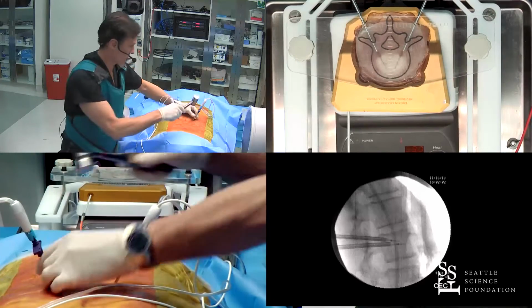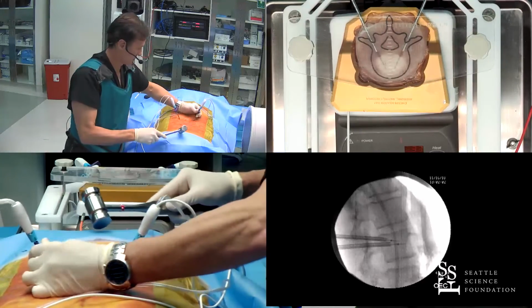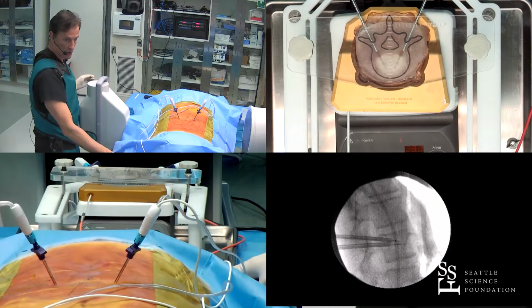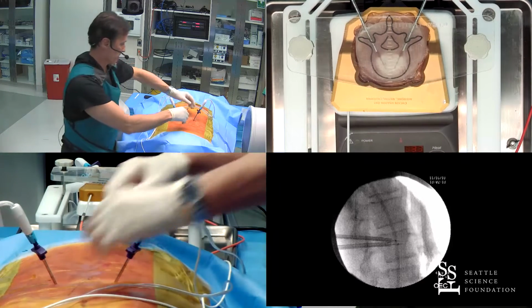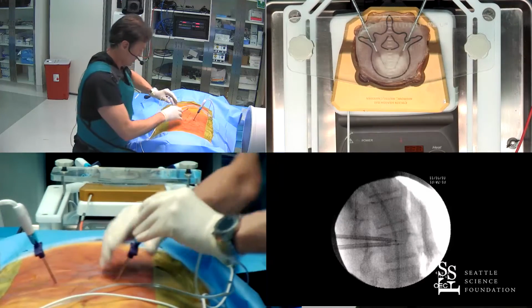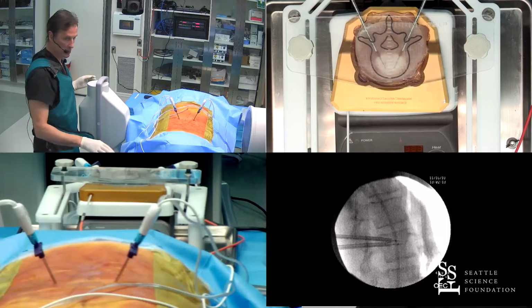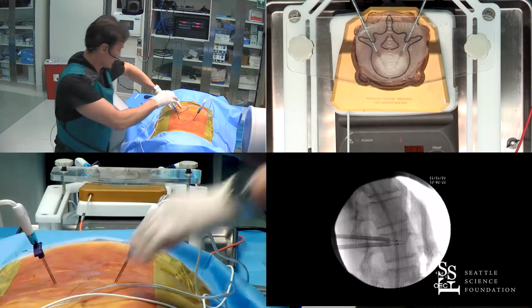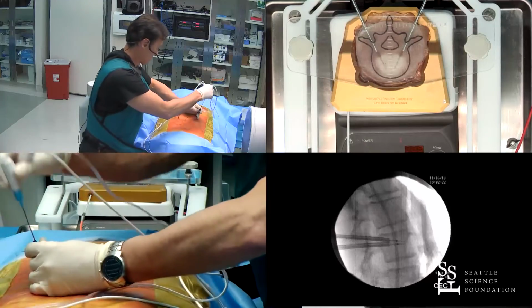Okay, so, very symmetric. Pull the cannula back on this. And then we're ready for the burn that we just demonstrated here. Okay, fast forward, so as not to take another 15 minutes for the ablation.